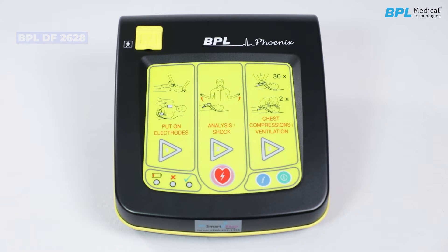Device overview. The BPL DF 2628 is an automated external defibrillator which is user friendly and easy to understand, with audio and visual prompts. The self-explanatory illustrations and illuminated symbols help to deliver therapy more quickly.